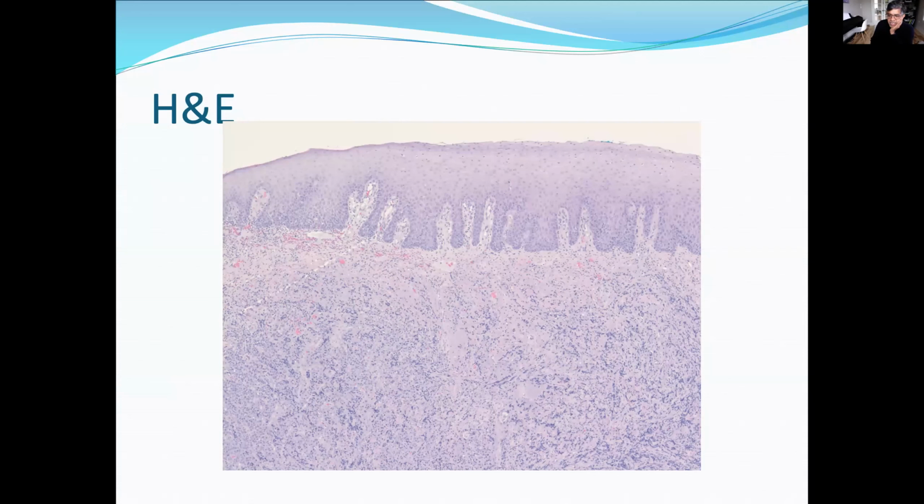Okay, there are some really nice choices coming up in the chat. That's almost right there. Yes, EBV mucocutaneous ulcer. Okay, that's a wonderful chart. Let's keep looking and maybe we can get to a diagnosis there.